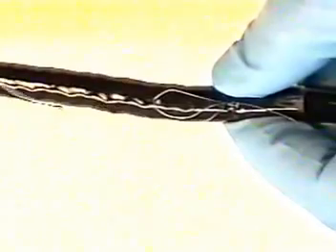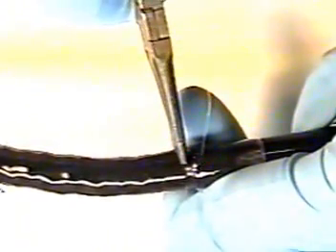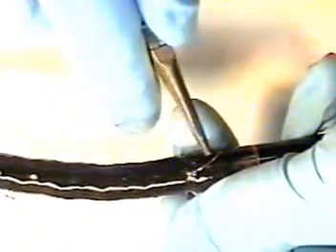Again, this is using black silk thread. Once we have made the additional 3 to 4 turns, we will pull our thread through the loop again, keeping a good tight grip on your thread without snapping it. We will pull the first set of loop, which will pull flush up to the loops, then pull through halfway, but not all the way, as to untangle your binding.